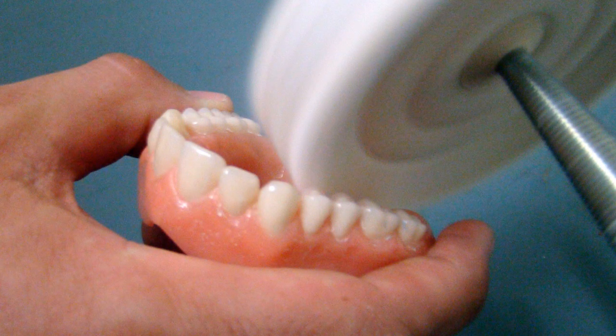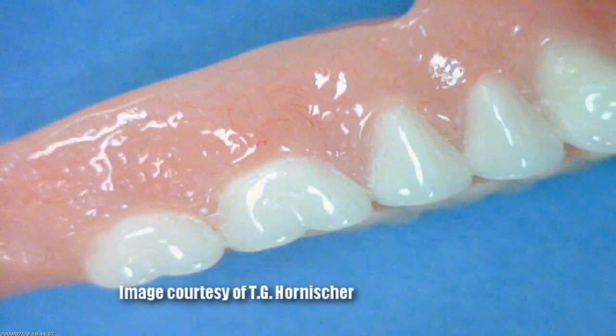it smooths and polishes at the same time. And what a polish — outstanding — and that goes a long way towards suppressing the buildup of surface plaque.